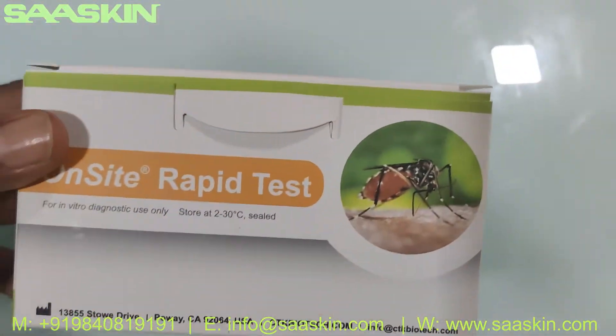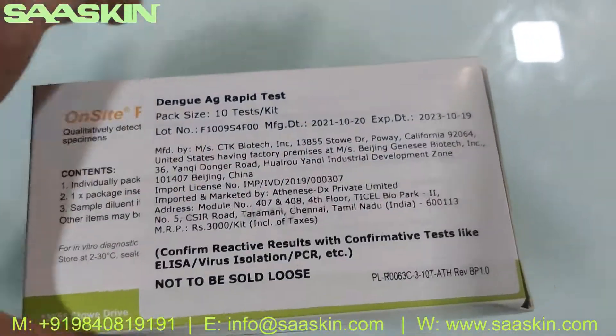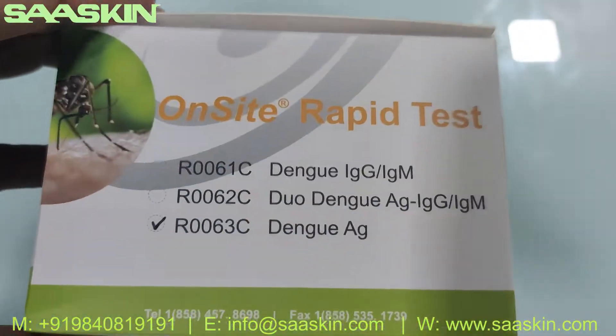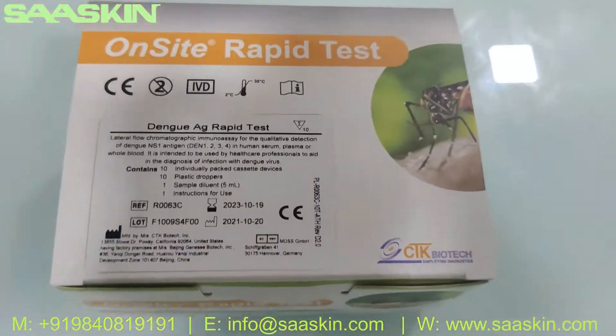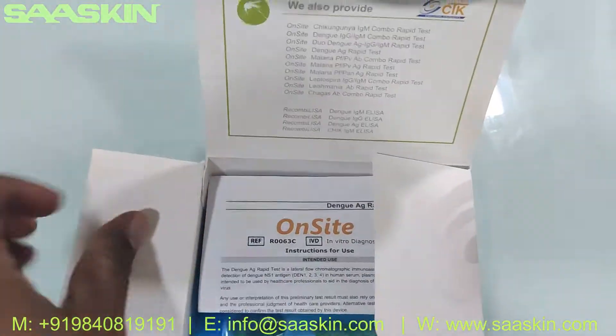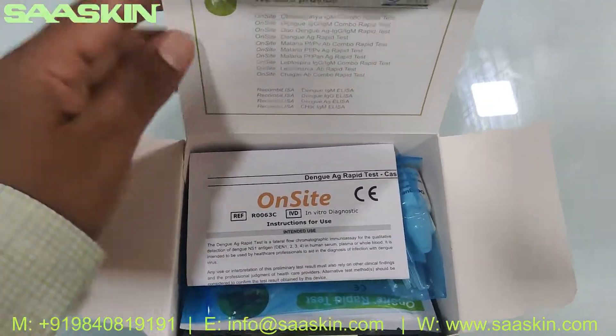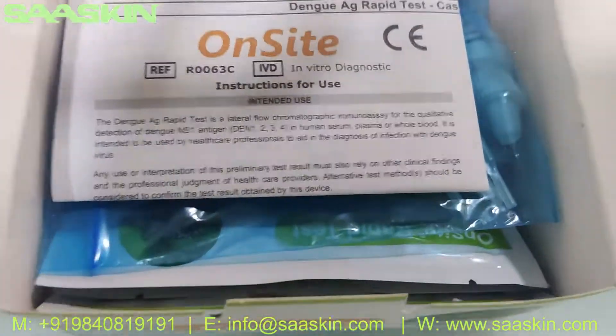Going around the box, this is what the box looks like. Here is the box — let me unbox this for you. You can see inside.